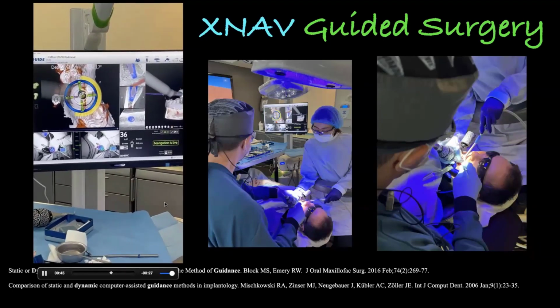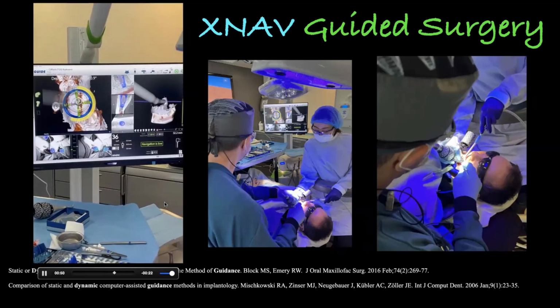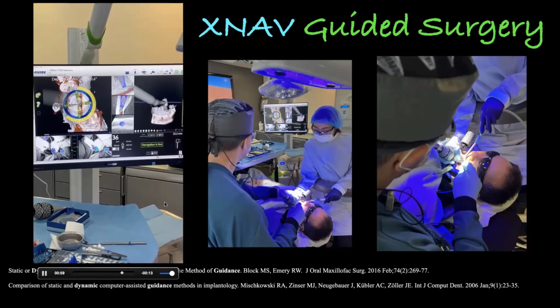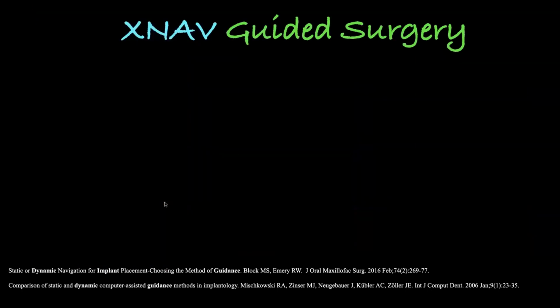So these type of technologies are one of the massive added benefits of having a CBCT. Now you can do guided surgery, but also you can get a real-time guided surgery unit and utilize real-time guided surgery in your cases as well, which is really, really fun and really informative and just really allows you to be that much more predictable and accurate in your surgeries.